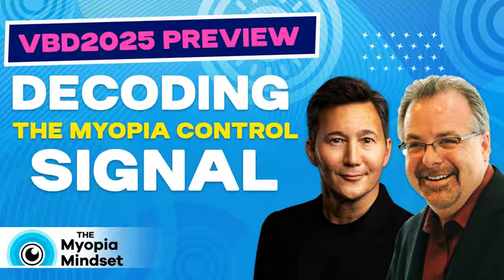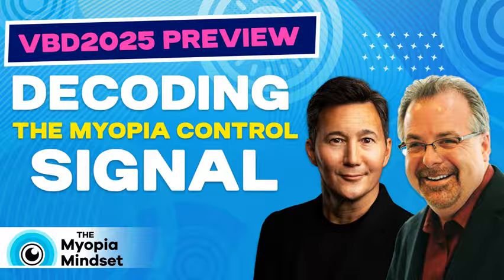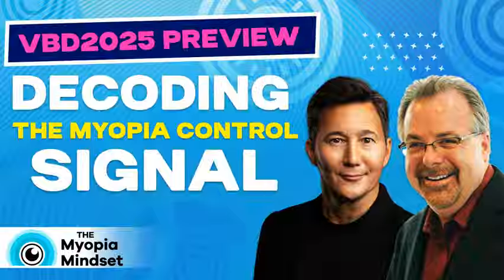And I'm reminded of that retrospective 5-year study by Eddie Chow that showed that, by utilizing multi-curve lenses and steeper reverse curves and aspheric optic zones and Jessen factor, et cetera, he improved results over a standard 4 or 5 curve design. So speak about how things have changed for you guys, and how was Dr. Chow's work an influence on you, and walk us through how things have evolved over this long period of time to where we are now.